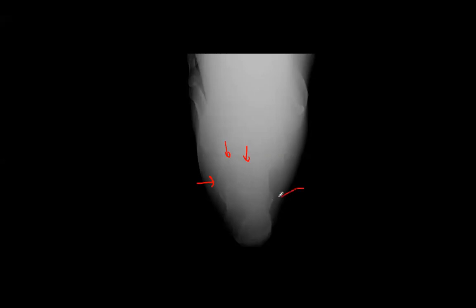Okay, and what does this represent over here? Well, that there was, it's like a buckling. Yeah, so what fragment is this one right here? What do we call that? The most stable fragment. Good, because it is attached to the deltoid, and it's the sustentaculum tali fragment. Good. So we can see the tuber of the calcaneus is buckling on it here, so we're getting some shortening that way, just like we see with fibular fractures. And then what's the overall varus alignment? Good, varus position, good.